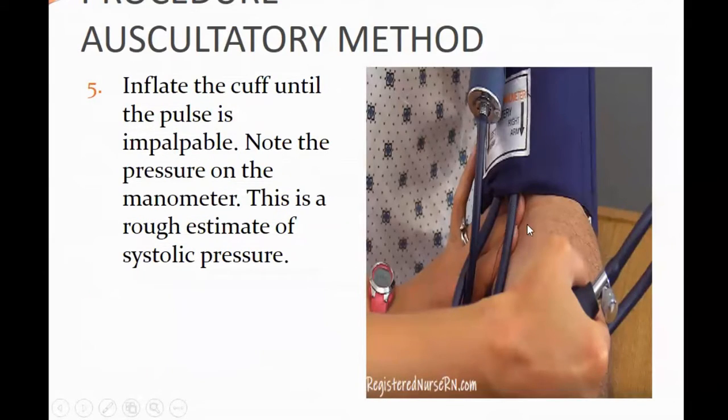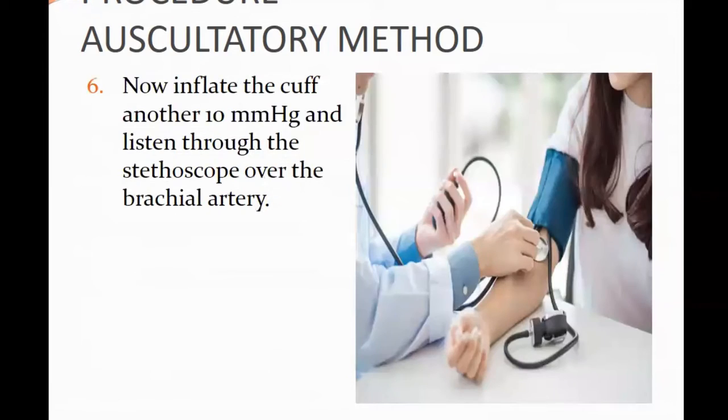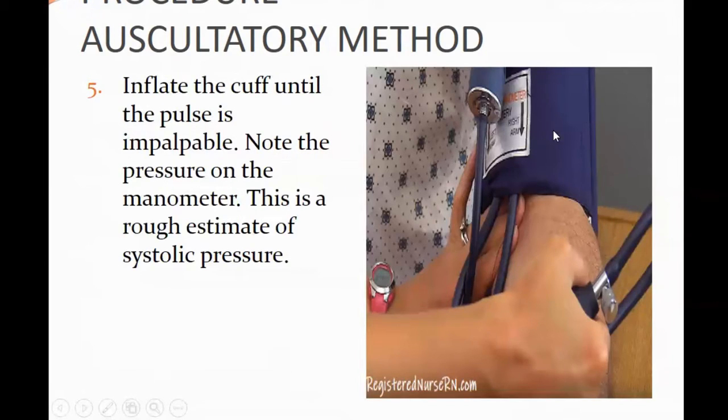Now, keeping your hands over the brachial pulse, you are going to inflate the cuff with the help of this hand bulb until the pulse becomes impalpable. Once you have located the brachial pulse, you keep your fingers there and inflate the cuff with the hand bulb, and when the pulse becomes impalpable, you note the pressure, or read the value present on the manometer, and this will be a rough estimate of the systolic pressure.